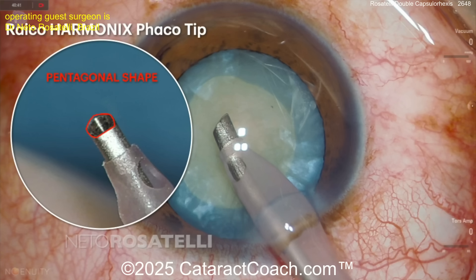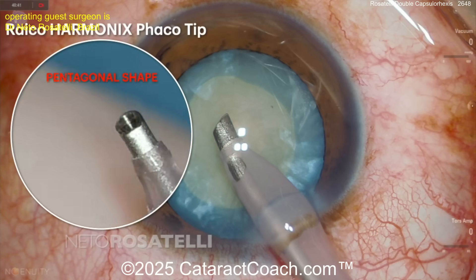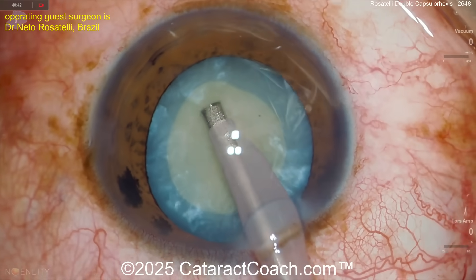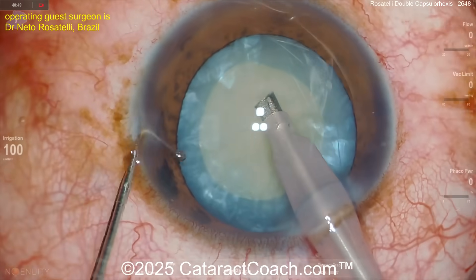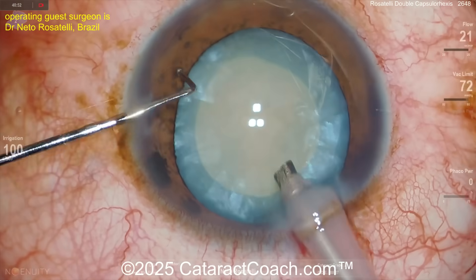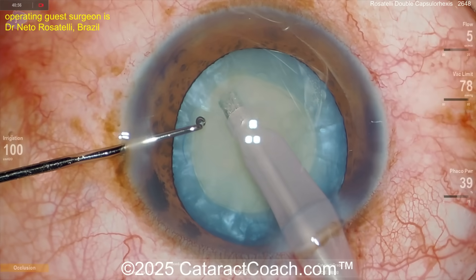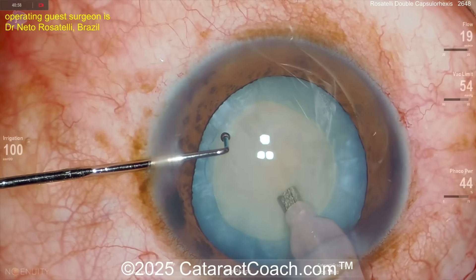There's a new phaco tip he's been using, and it has a pentagonal shape — it's not round. This is going to help cut through this denser nucleus pretty easily. That pentagonal shape gives you torsional, rotational phaco movement and ultrasonic energy that should help break it up faster. Here comes the groove down the middle.